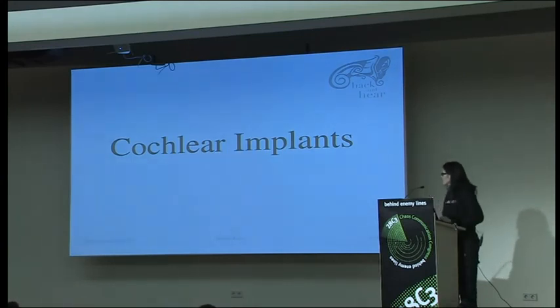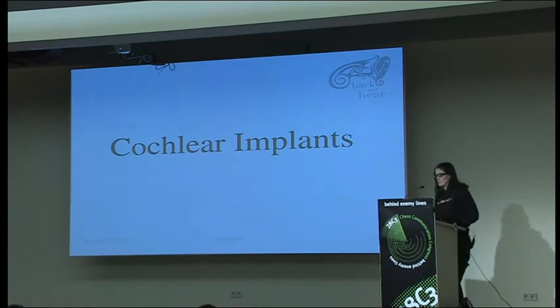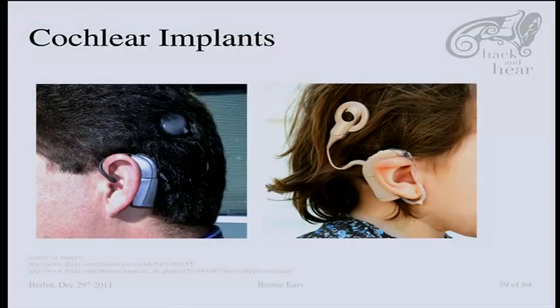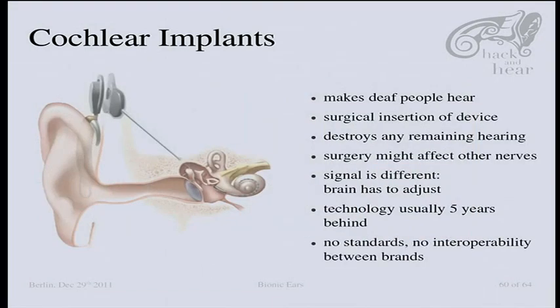We have a little bit more time, so I will talk about cochlear implants as well. I mentioned that those are the ones that I have implanted in the head and also have an external device. This shows this part is implanted and they have a wire that is drawn into the cochlea and it's connected to the nerve. So actually the whole ear is circumvented, only the wire goes directly to the nerve and then through to the brain.